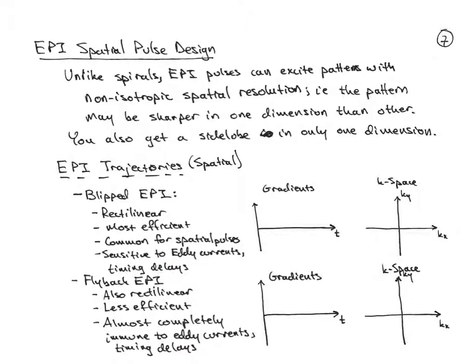So let's plot out what the gradients in the k-space would look like for this trajectory. So here are the gradients. It's bipolar, and on each plateau, we play some RF. So this here I'm illustrating is the GX gradient. And in between each plateau, we play trapezoid blips in the other channel. You know what I should do is use a different color for that.